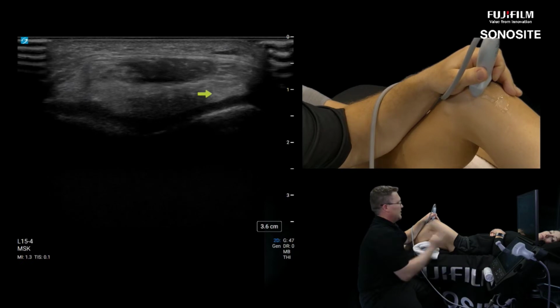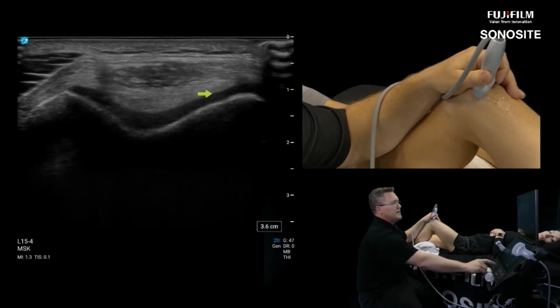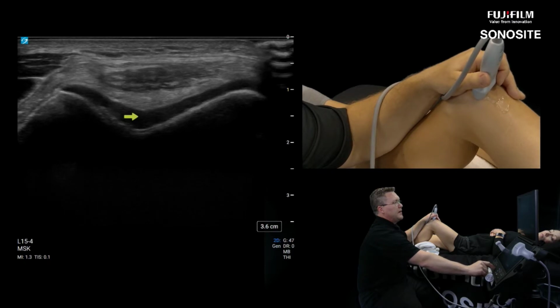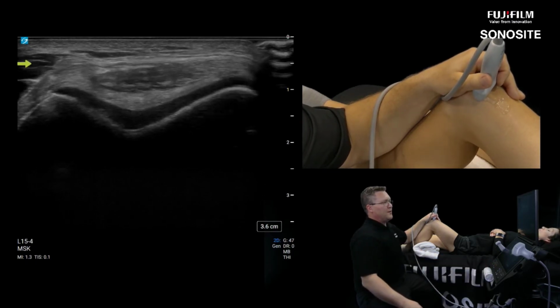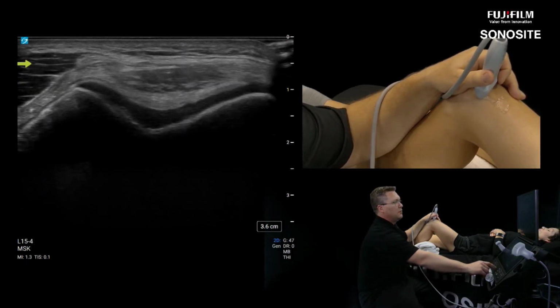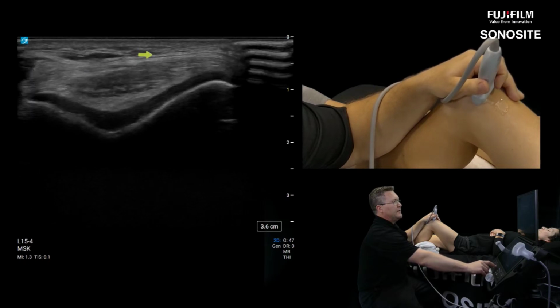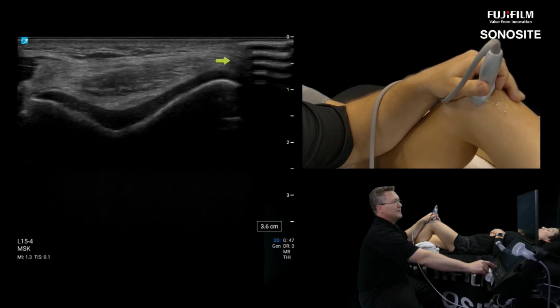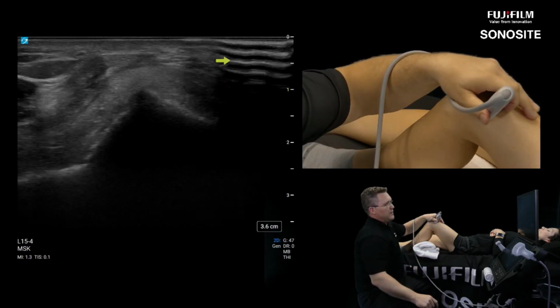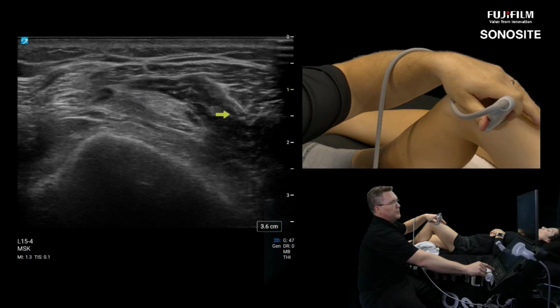And I'm going to climb more proximally again. Here we have the distal femoral trochlea. And then right off the bat, check it out, I can tell again, left side is medial. I always see that more distal musculotendinous portion of the vastus medialis oblique. And then lateralis hasn't even come into the shot yet. It's all tendinous, okay? So if I were to turn my probe a little bit here and climb laterally, I could evaluate the quadriceps tendon of the vastus lateralis more proximally and laterally over here.